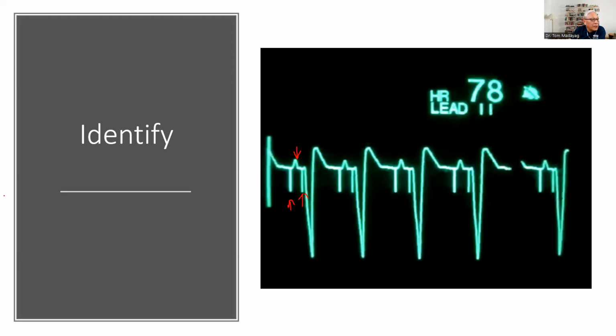Biventricular pacemaker, Michelin, is this the same as a CRTP? CRTP. I'm not familiar with the term, Michelin, so I don't know how to answer you. Or maybe my answer to you is I don't know.